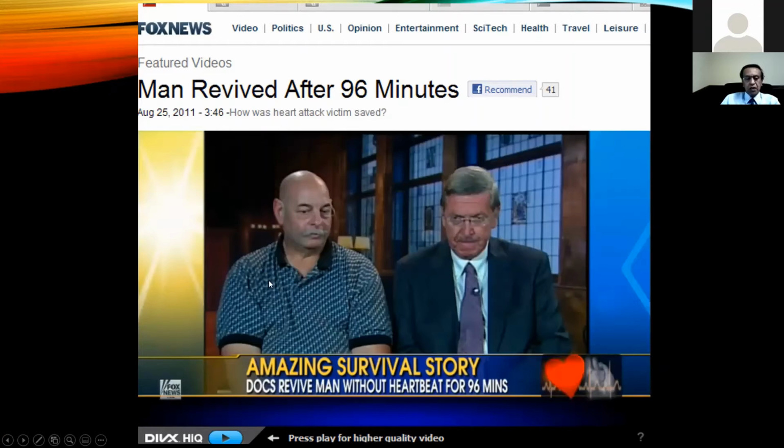However, one of the nurses who came to resuscitate this patient has substantial knowledge about capnography, and she realized that when they measured CO2 during resuscitation, the end-tidals were consistently around 25 millimeters. When she called the physicians in the emergency room and sought their advice, they said if the end-tidals are pretty good, continue resuscitation, and they were able to give several shocks.